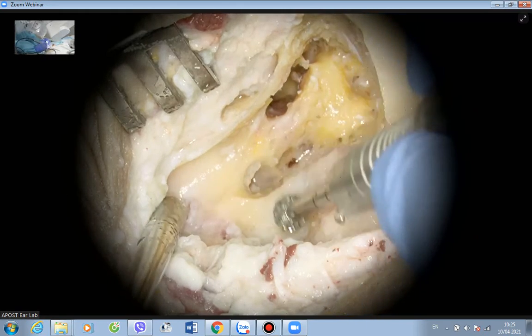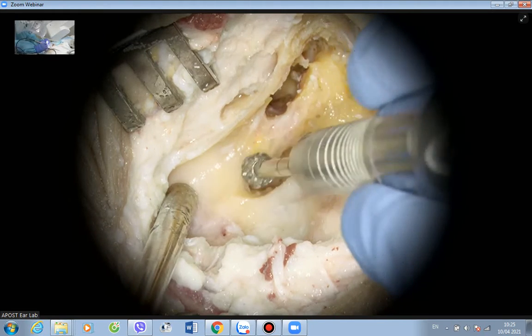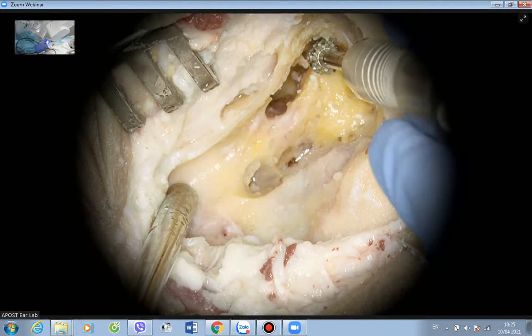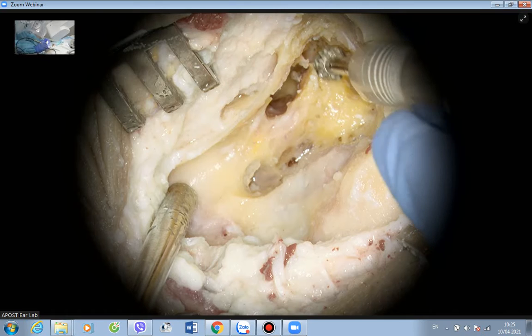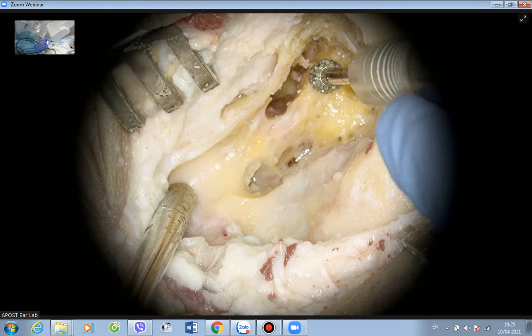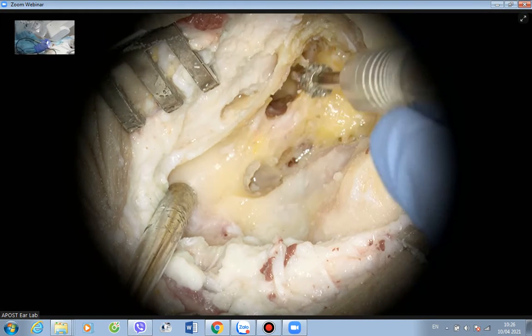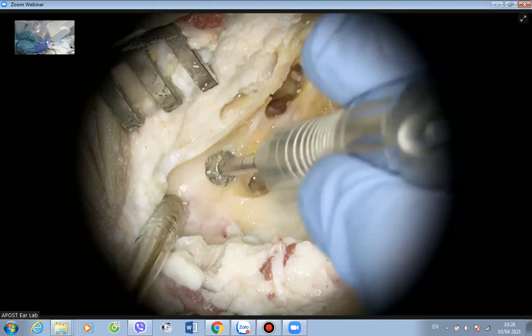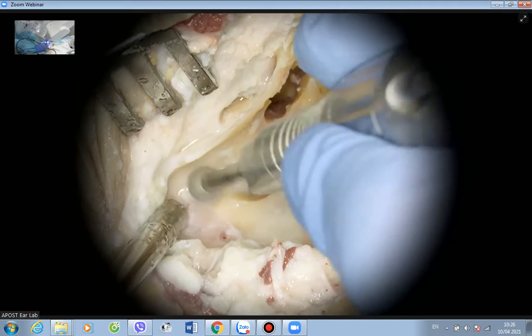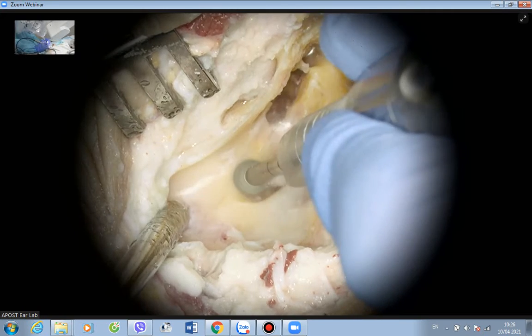And basically, if you can find the digastric ridge here, and you can find the short process of the incus and the lateral semicircular canal here, it marks the second turn of the facial nerve. Then you draw a line, and basically you can imagine the facial nerve is here. So if you continue to do the dissection, then you will delineate the whole course of the facial nerve.